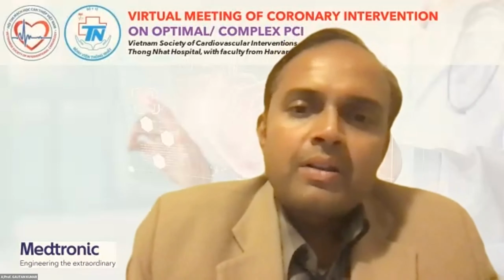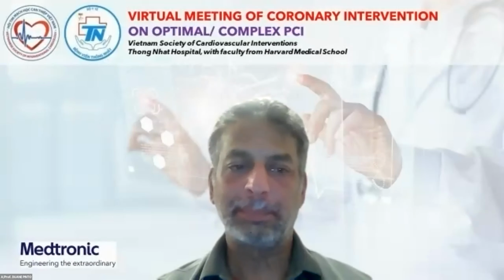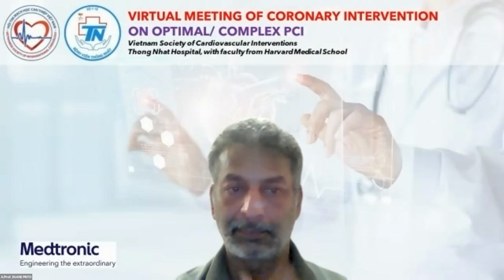Yeah, thank you. Dr. Hung, those were fantastic CTO cases that you showed. These would be wonderful cases in any center. Now, I just had one question about that left proximal LAD CTO that you had. Did you consider IVUS guided puncture as a possible option in that case?